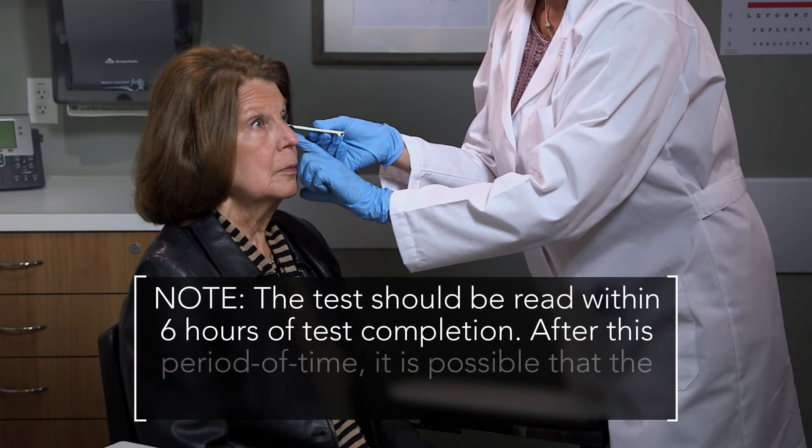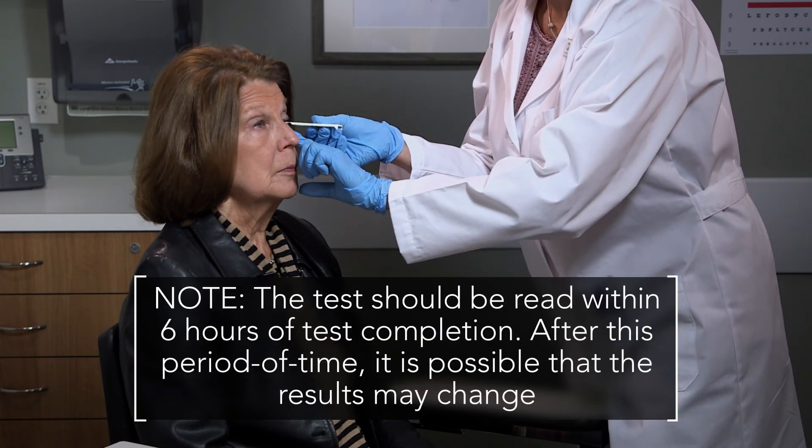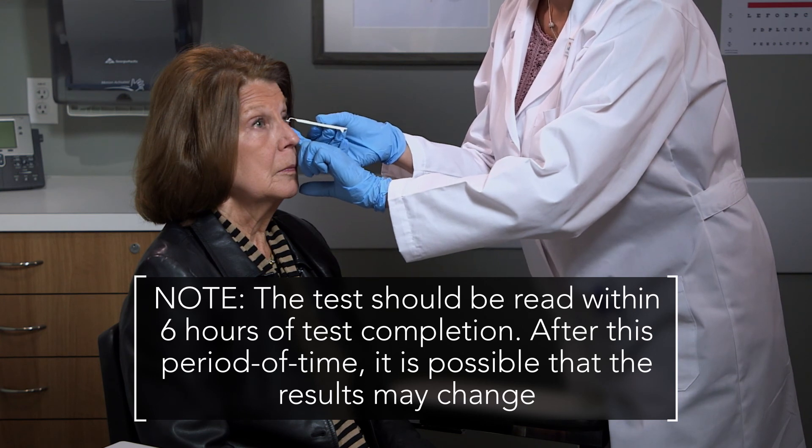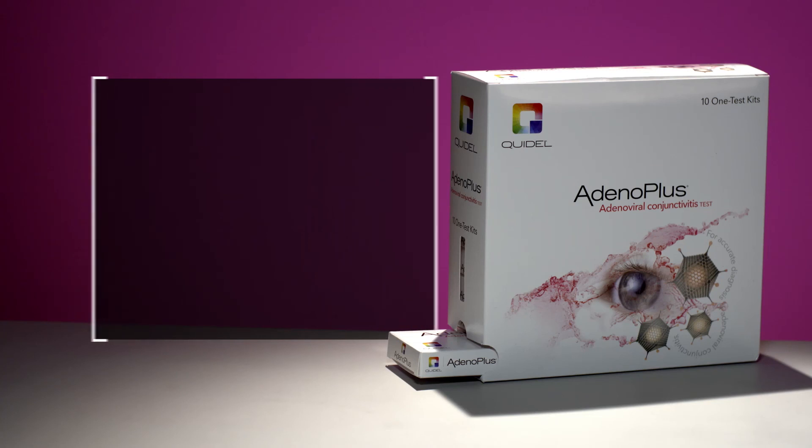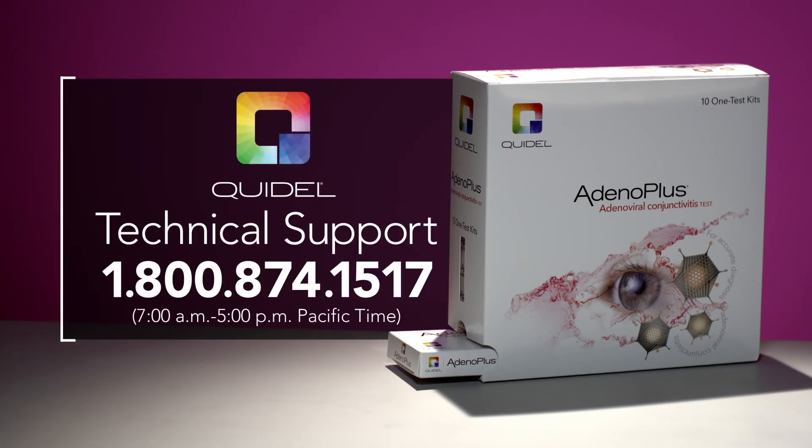The test should be read within 6 hours of test completion, as after this period of time it is possible that the results may change. For assistance when running the Adeno Plus adenovirus test, contact Technical Support at 1-800-874-1517 between 7 a.m. and 5 p.m. Pacific Time.